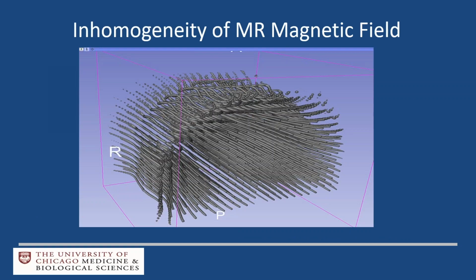The difference between MRI, of course, which is what we all aim for in intraop MRI, and CT, is MRI gives you beautiful anatomic resolution and contrast. But if it comes to exact precision, we have a problem, because we have a non-linear distortion of the image, which means that it's more distorted, as you can see from these magnetic field lines, in the periphery than in the center, which means if you're operating in the center of the brain, implanting a deep brain stimulator, it's probably not relevant. But your fiducials are in the periphery. So if they are slightly distorted, then you don't get a complete orthogonal image.